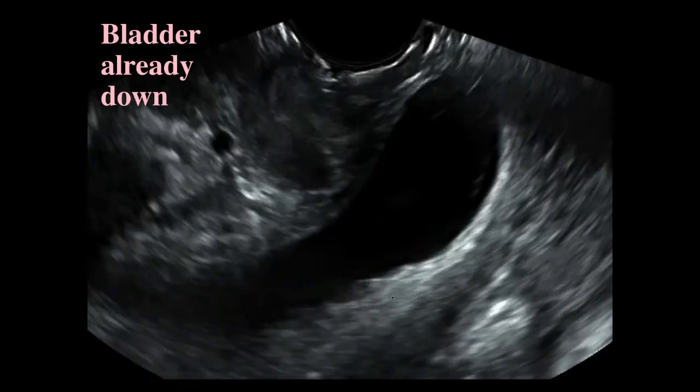So let's look at this in real time. So here's somebody who's already got a bladder prolapse. You can see the urethra is bent to a certain extent. This patient can't void completely, has urinary tract infections because she can't void, and she's got this thing that's already sitting in her vagina. So let's see what happens when she Valsalvas.